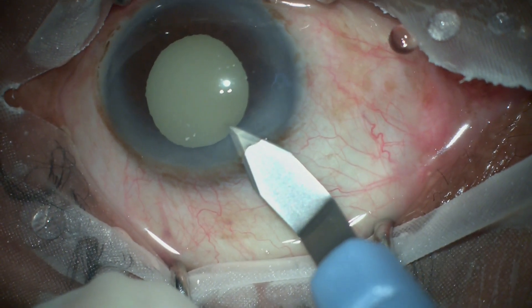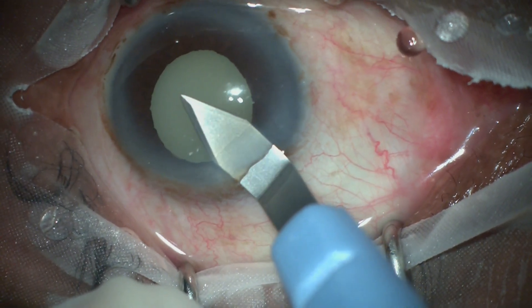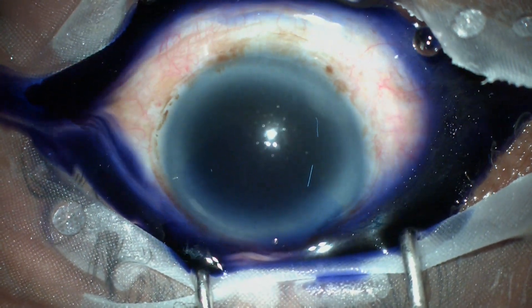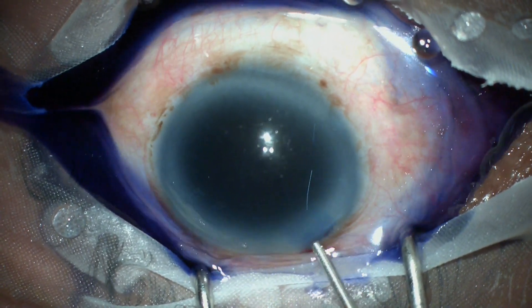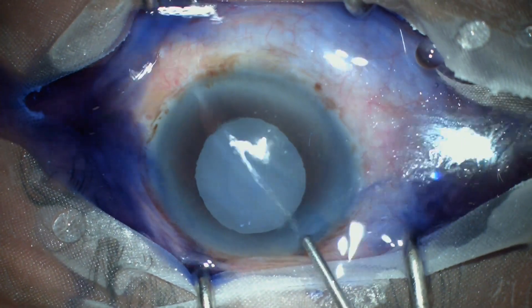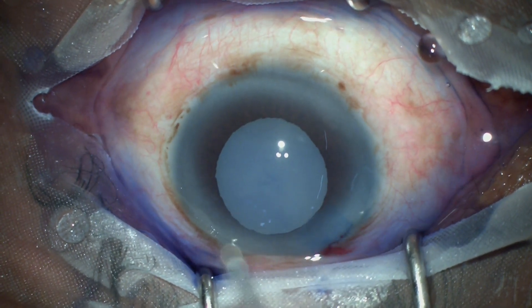This is where we have started the surgery. A clear corneal incision is being made. The nucleus is at the bottom of the capsule, so it is not visible. Trypan blue dye is being injected to stain the capsule, because in these cataracts there is no red glow, so the capsule cannot be visualized until properly stained.